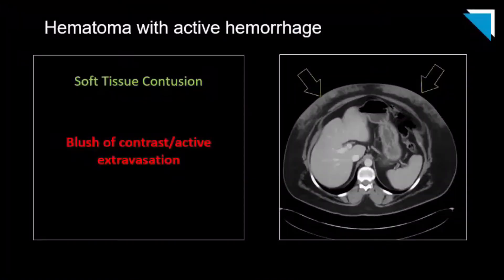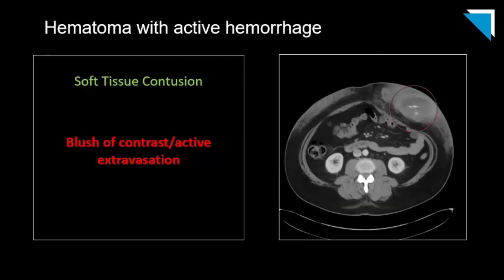In this trauma patient with a history of crushing injury, we see extensive subcutaneous soft tissue contusion. As we move further down, we see a focus of contrast density in the subcutaneous soft tissues compatible with active hemorrhage. The density matches the arterial phase, so this is likely an arterial hemorrhage — and this looks basically the same as it does anywhere else in the body.